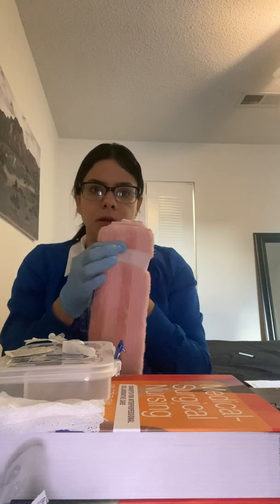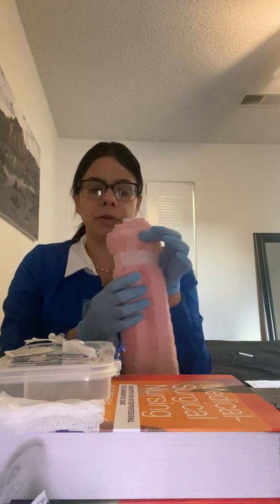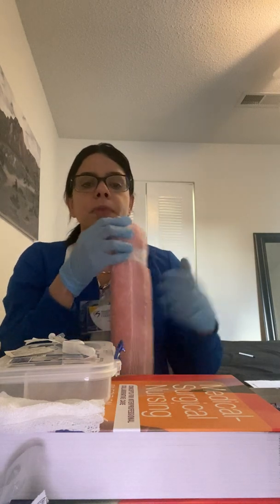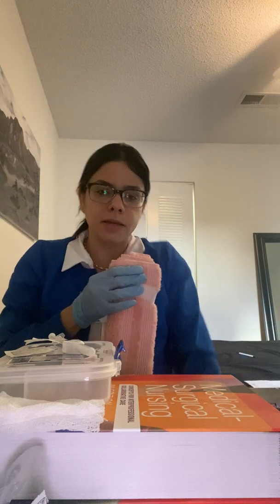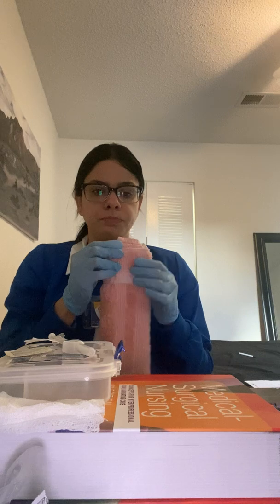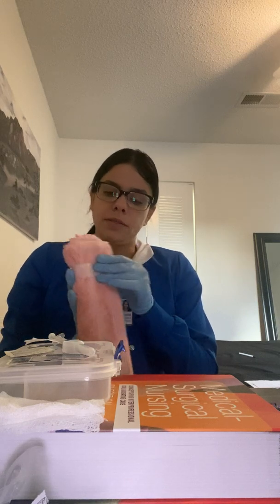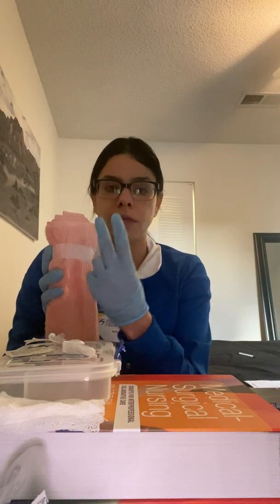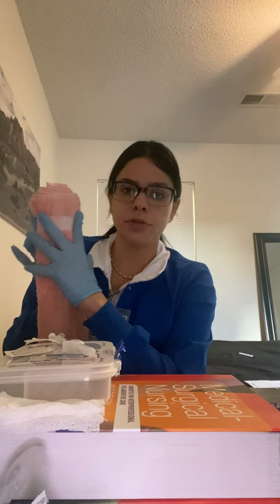Like I said, this is the arm that I'm going to be using. Just pretend that this is the shoulder area and the arm is going down. I'm going to instruct my patient to relax and have the arm hanging on the side like this. And the way that I'm going to be injecting it, I'm going to have these two fingers, my index and my middle finger, in a V shape like this.